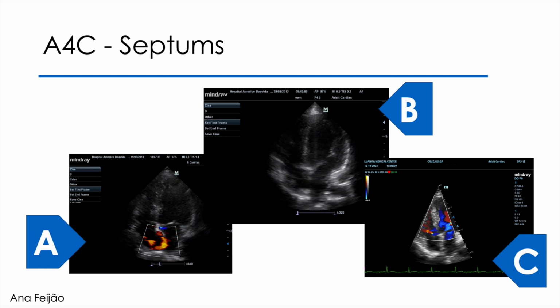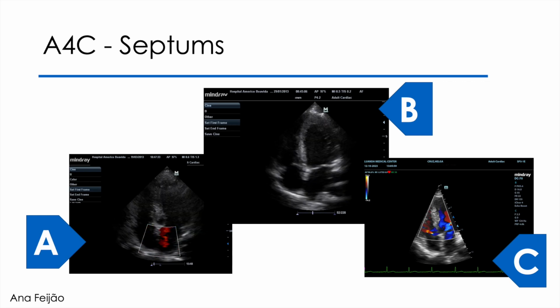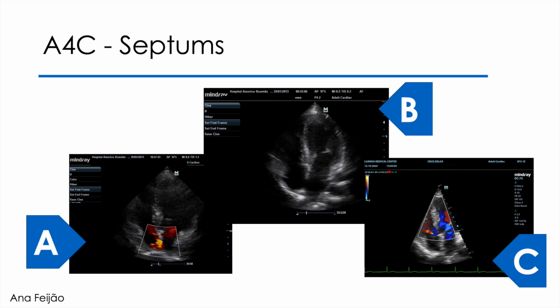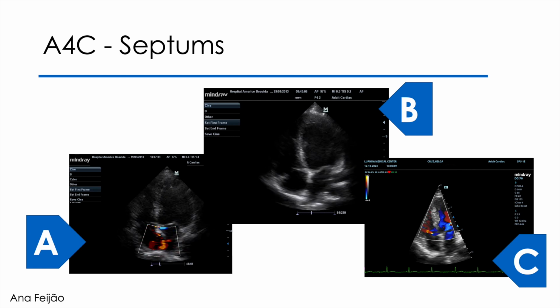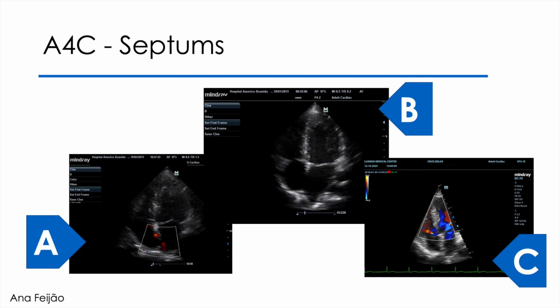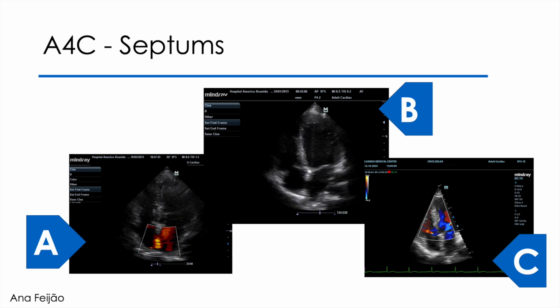We must call the color Doppler, make the sector window as small as possible to improve the frame rate, reduce the overall gains, and set the color scale to a speed that does not cause aliasing, like 50-60 centimeters per second. And with the color sector above the area we study, I tap the probe a little bit to see if any strange flow appears in an extra plane.